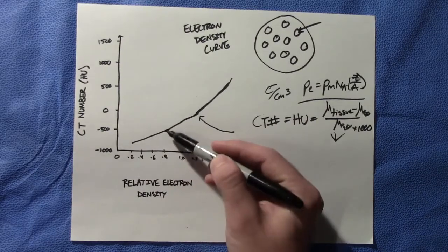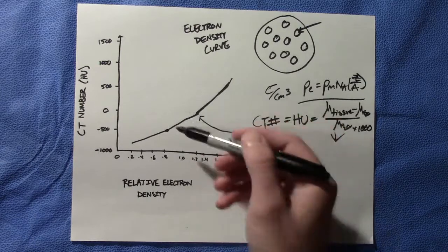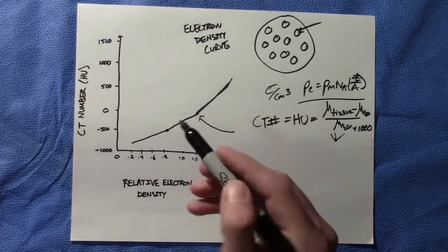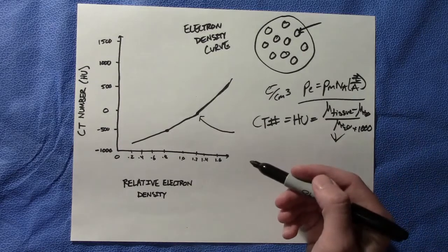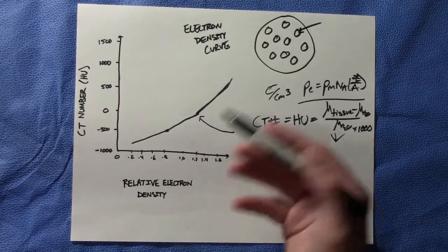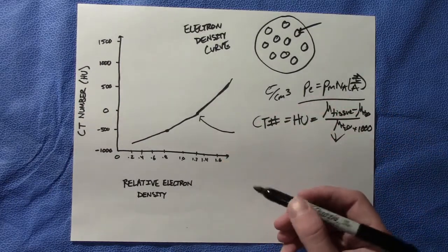And then it's going to look and say, okay, the relative electron density is approximately 0.8, and that is what it's going to use to calculate the dose. And so if this graph is wrong and your values that you input are incorrect, then that is going to show up in your TPS, and you are going to incorrectly calculate dose, which will then go into mistreating the patient by some amount of dose.